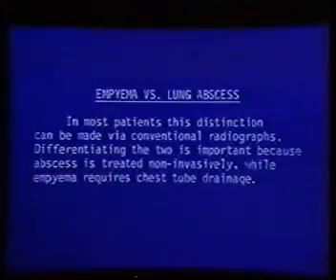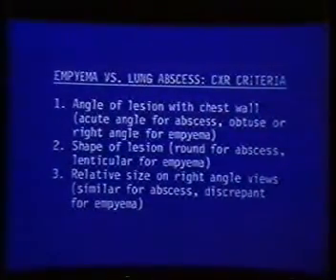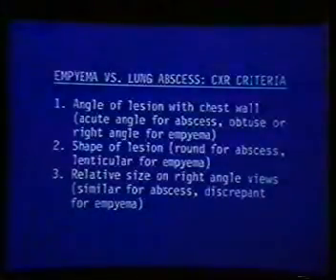And this is a very important distinction because the clinical treatment that you're going to give to a patient will be markedly different if you think somebody's got an infection in the pleural space that's going to require drainage and a more aggressive approach. If you think somebody's got a lung abscess, you're much more likely to attempt to get by with antibiotic therapy, percussion and postural drainage, and so on. So this is a very important distinction. It is one that can be made in a large number of cases just using plain chest radiographs.